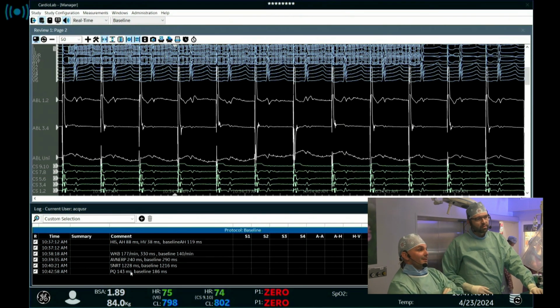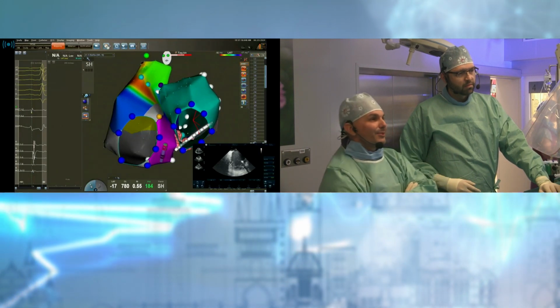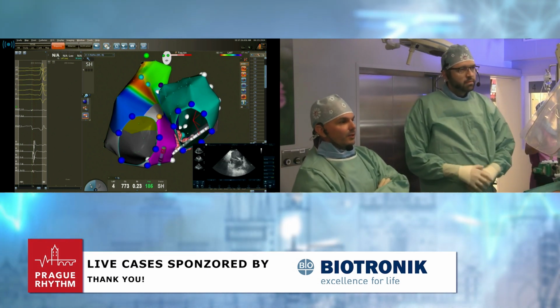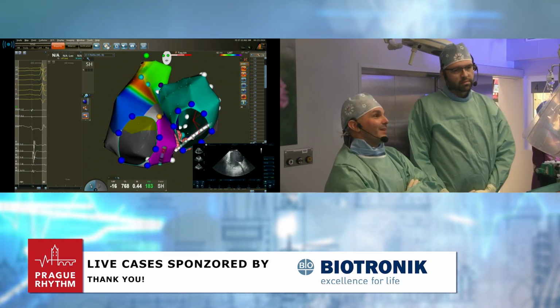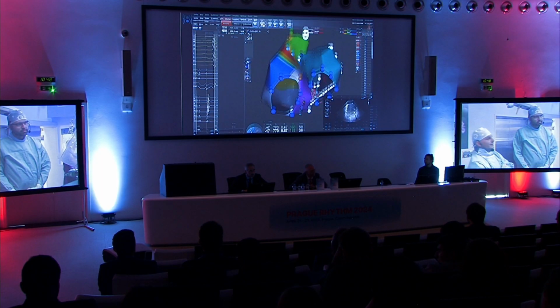Yeah, so I'm very satisfied because with Predrag we did a procedure tailored especially for the patient. So we did only AV block, we denervated only the AV node, but did not touch the sinus node. So I think we are happy, and the patient should also be happy. Okay, any questions for the operators? Oh, please.